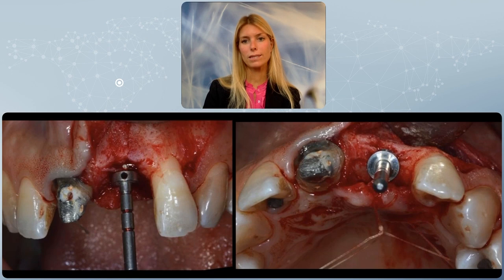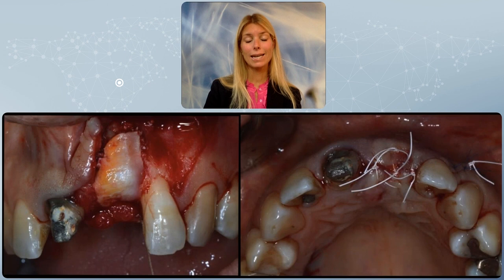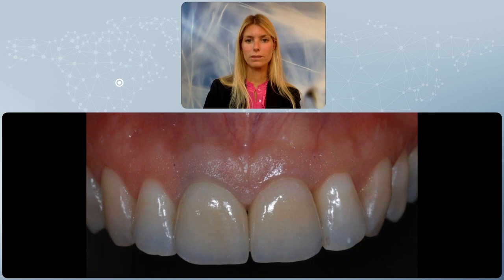So we perform a traditional straightforward horizontal GBR in conjunction with implant placement, where the particles are gently positioned and adapted without over contouring necessarily the area, and following again the biological principles, we cover this with a collagen barrier membrane and a connective tissue graft overlying on top to be able to achieve a nice aesthetic result. And at the end of the day, the patient was finalized with a very natural looking smile, and in fact the natural tooth on her right hand side shows a small grey shadow due to the post and core that was used, but of course this is just a purely cosmetic defect which wasn't bothering the patient at all. The implant itself is looking very much natural.